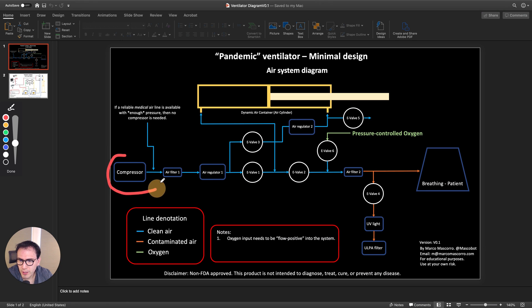There is a compressor over here — this entire section is the air coming in. Some hospitals have what is called medical air, and if that's available with enough pressure it can be used with the system. If not, we use a compressor. The design process goes: air into a filter, then into a pressure regulator, and then there are two valves — the first one is open and the second one is closed.